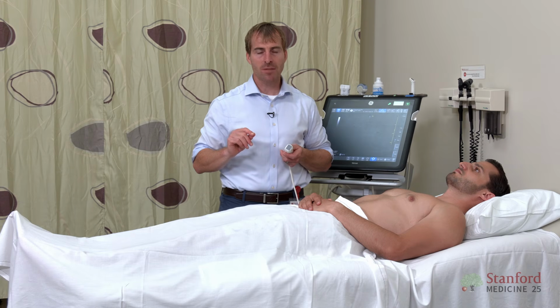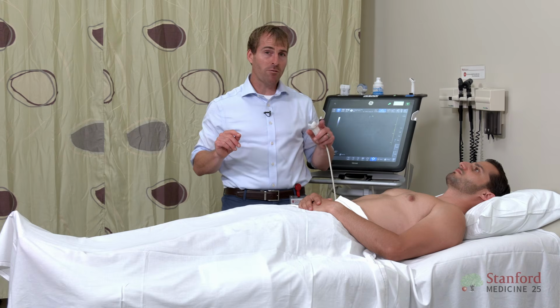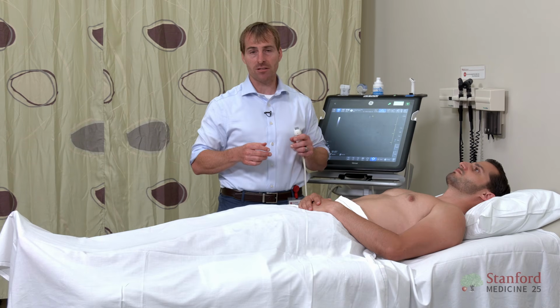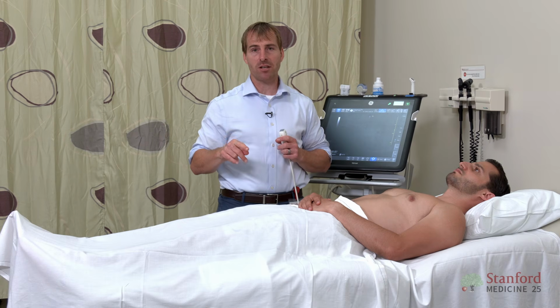So again, we make sure you're putting that into clinical context. Now, if your IVC is between 1.5 and 2.5 centimeters, that's normal. You can't interpret that more. If it's 2.4 centimeters, that doesn't make it more likely that your patient has an elevated CVP, okay? So you know the diameter is normal. You can have a normal diameter, though, and still have an elevated central venous pressure.